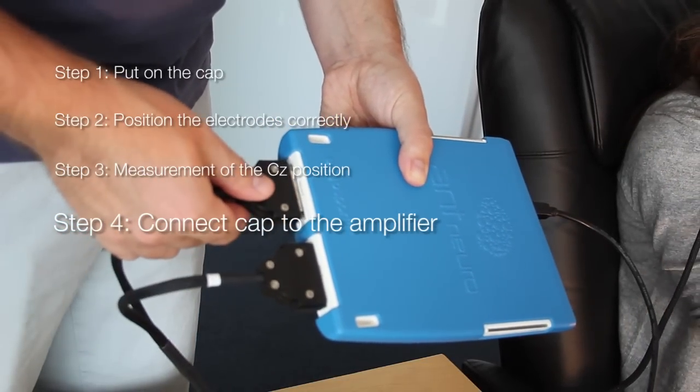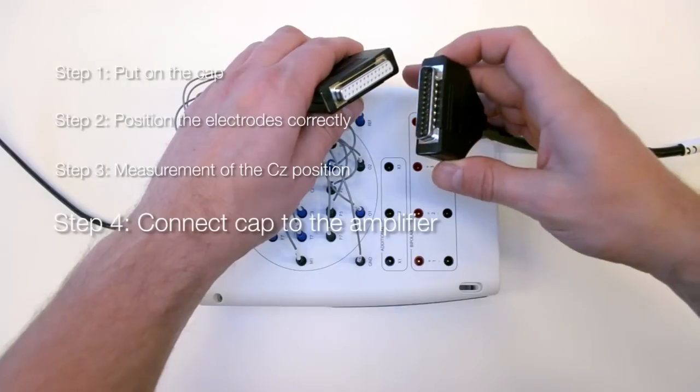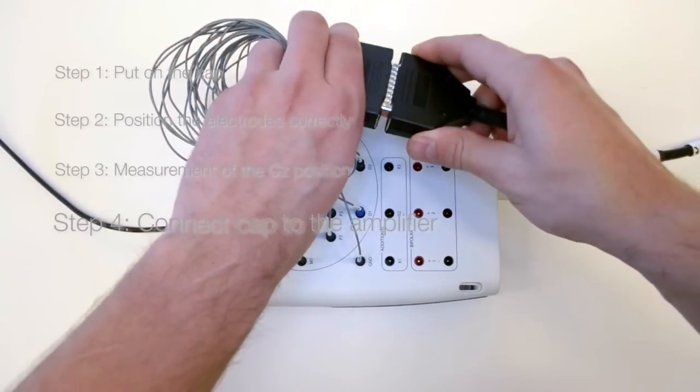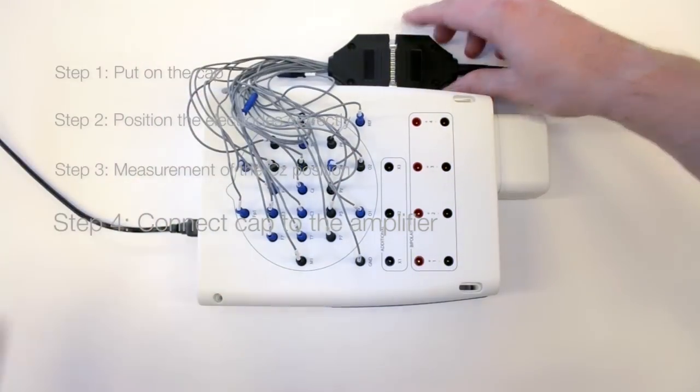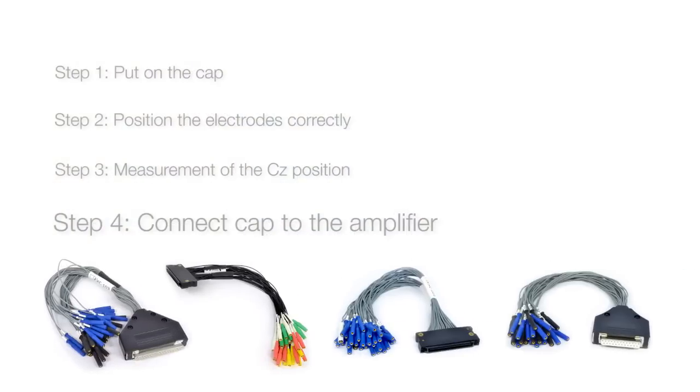Plug each of the labeled cap connectors into its corresponding amplifier port. The cap connectors are compatible with EEG systems from a variety of clinical and research EEG manufacturers. ANT offers a range of adapters for connection to third-party EEG devices.